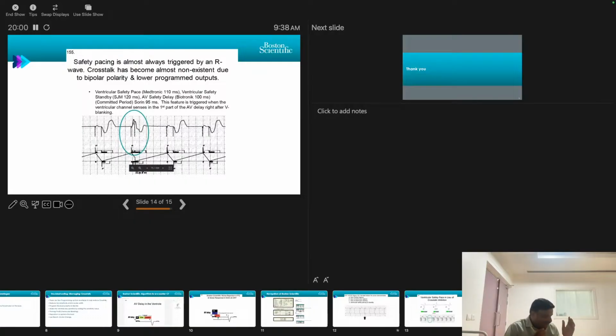If the atrial lead was dropped to the ventricle and it generates a pace, obviously it is going to deliver a depolarization. However, it was in the ventricle. We intended this lead to generate the atrial pulse. If the lead has already dropped to the ventricle and is in contact with the myocardium there, it delivers our pulse there, so it is going to have the QRS complex instead of the P wave, followed by a wait of 120 milliseconds.